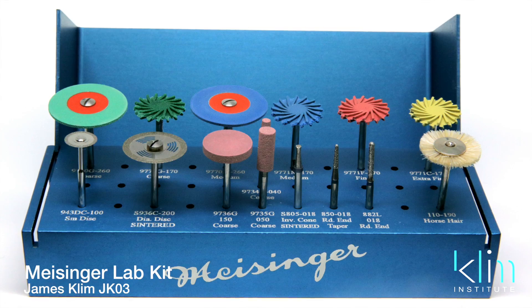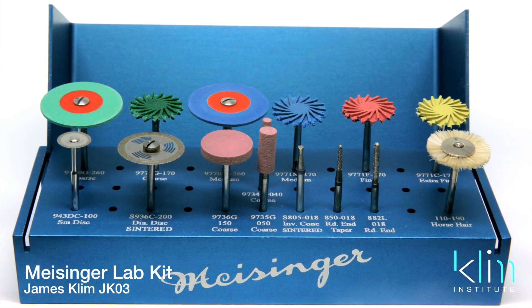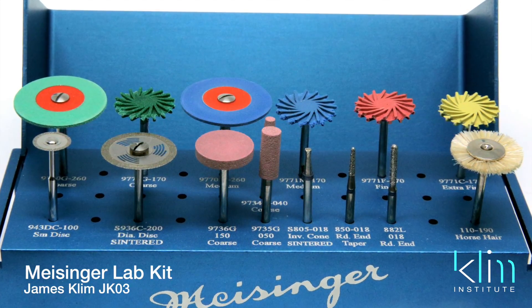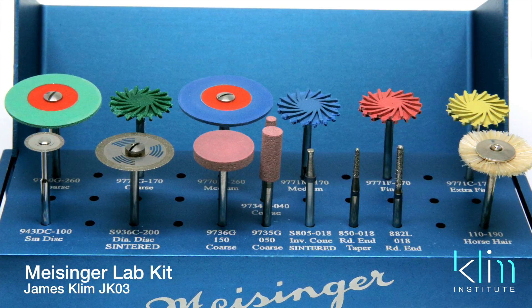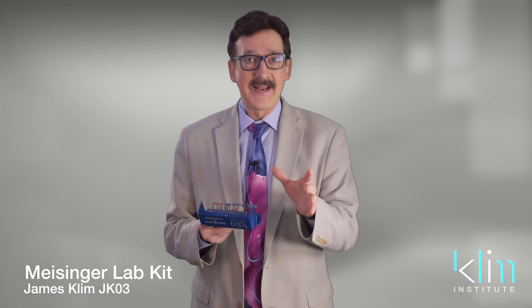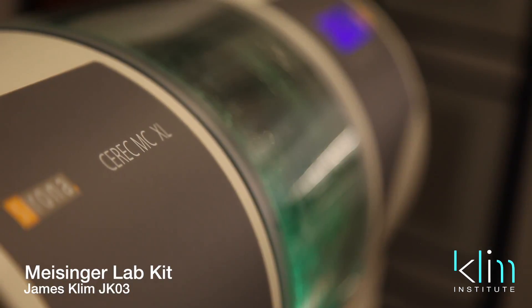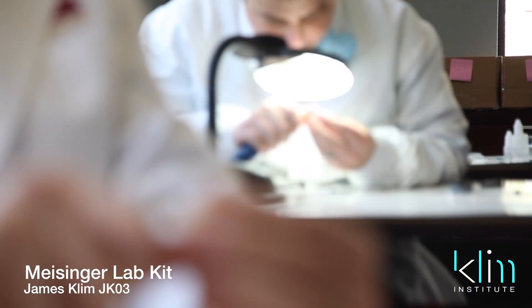What we tried to do was to put together a kit — I've worked with them for years now and we just keep upgrading it. It's called the JK03 Lab Kit. I want to go through the various polishers and shapers on this kit so we know exactly how to optimize them. A workflow objective I like to use when getting a ceramic ready to place in the mouth from the milling unit is to go in this order.